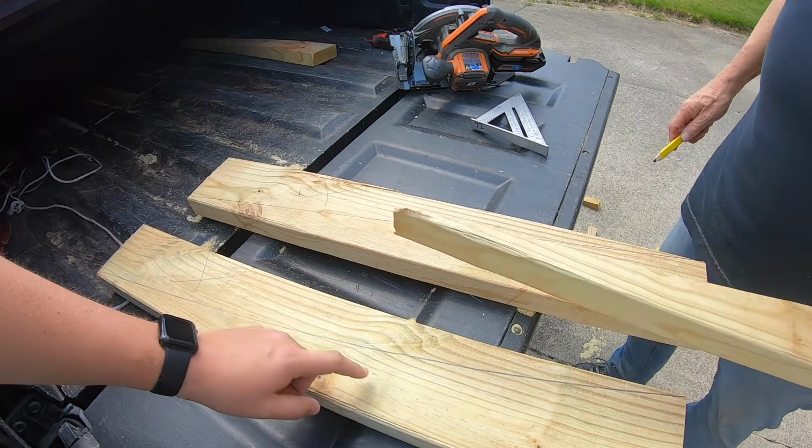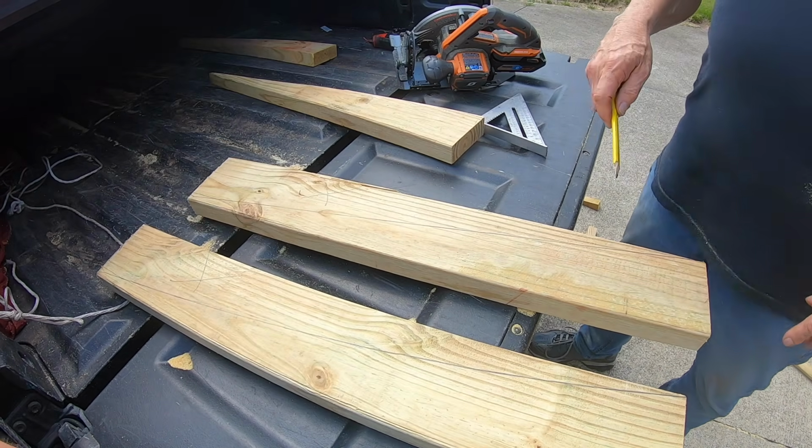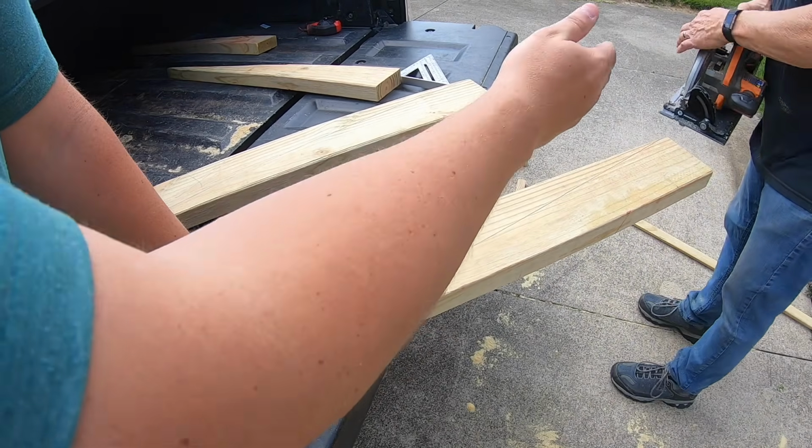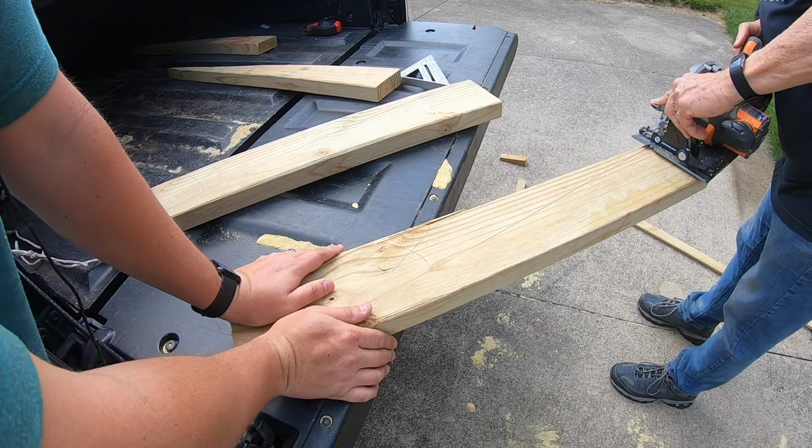And this is the good piece. This is the good piece. Again, the X's are the piece we're going to go ahead and scrap. So this is going to be cut the same way the first one did. You're going to go ahead and put a lot of pressure down and cut it. And then the second one will be just like it.